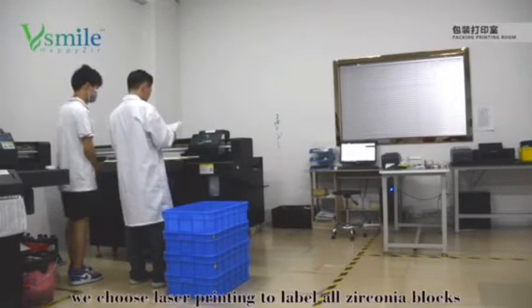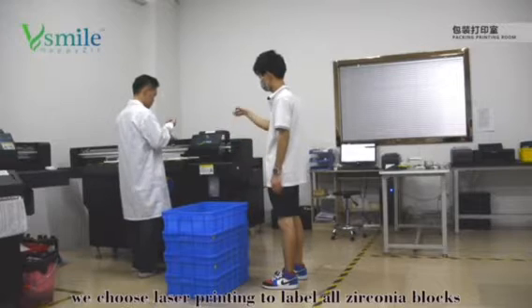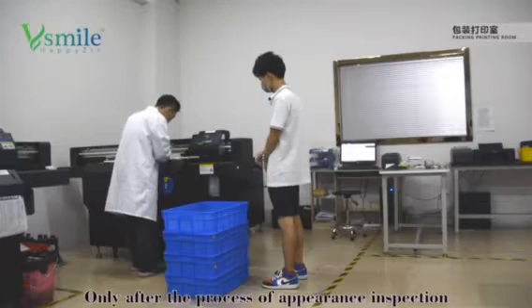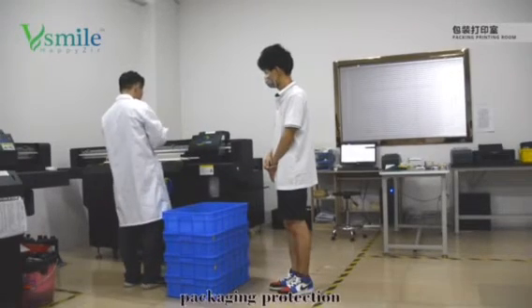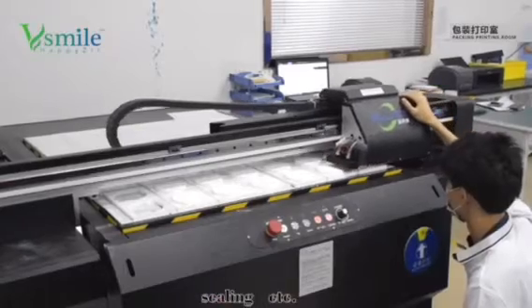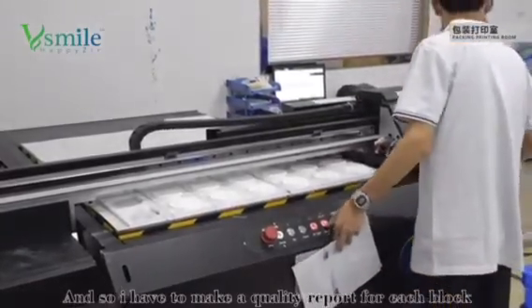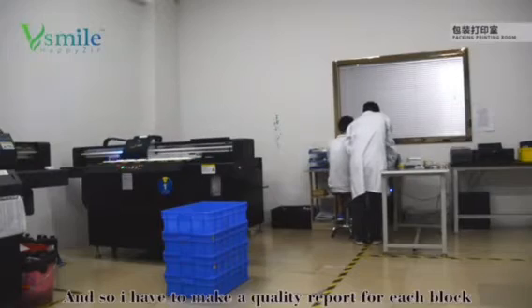We use laser printing to label all zirconia blocks with their own specifications. Only after appearance inspection, size measurement, packing, protection, sealing, and so on can they be shipped. I have to make a quality report for each block.